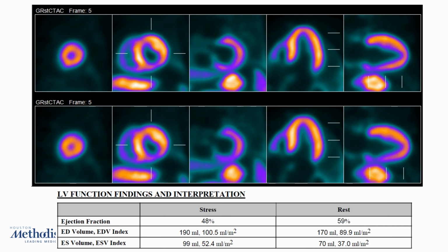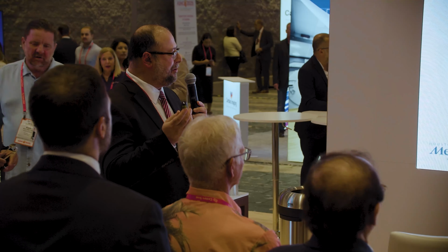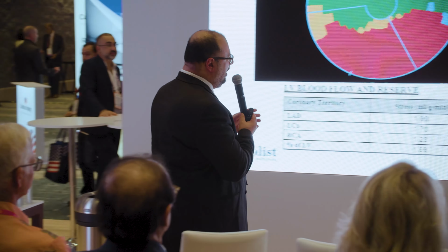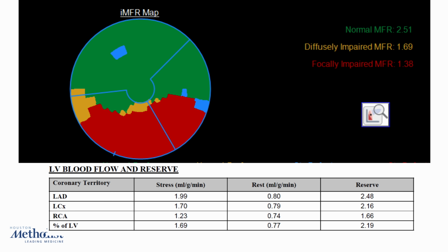All right, what do you want to imagine here? Inferior wall, akinetic, hypokinetic, what's happening? This one moves on its own quickly. It's giving you the answer. All right, single vessel or multi-vessel disease? Super dominant, right? Single vessel, LAD involved or not involved? So when I look at these numbers, obviously there is a large ischemic burden, a lot of myocardium at jeopardy. So this patient, I will be hesitant to treat them just medically.